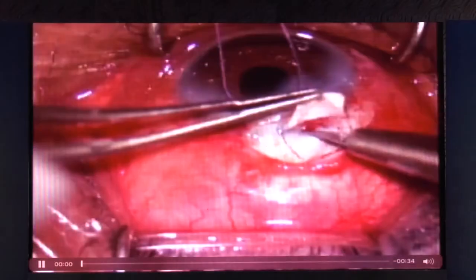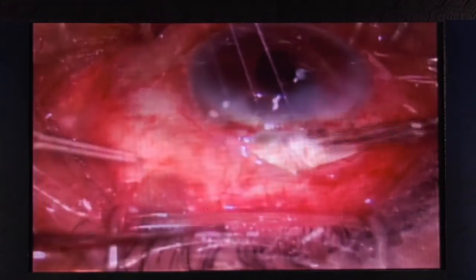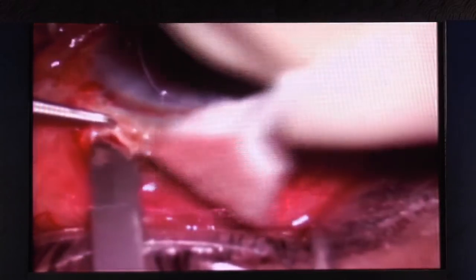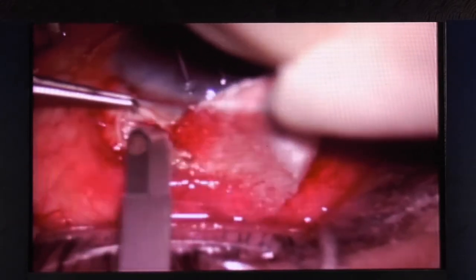A large tear, what do you do? I hope this is not the same resident, but essentially what they have done is, once again, they have torn through the anterior aspect of the flap, created a big tear, and this is clearly obvious. So the attending took over, and he actually used a scleral autograft, created a flap from the other side, and then patched that sclera over this particular area.